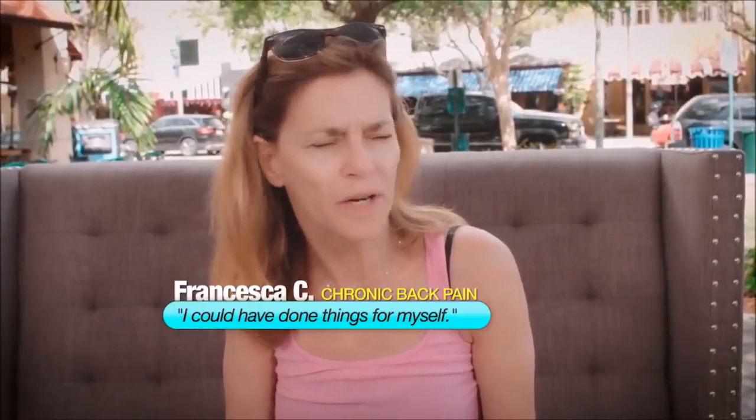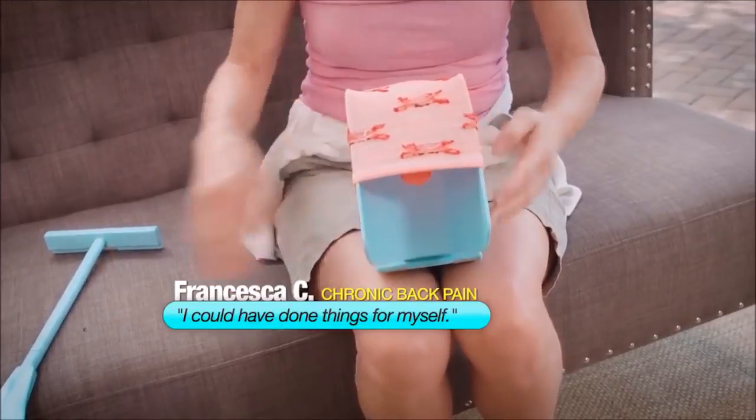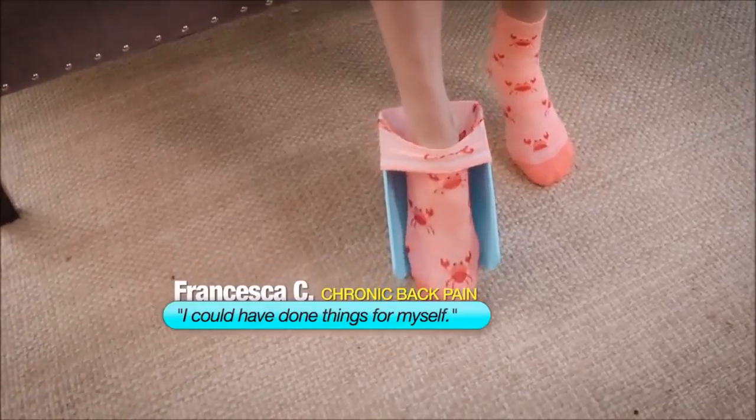I've suffered from chronic back pain for good portions of my life. And if I had had something like this, I could have been a little bit more independent and done things for myself.